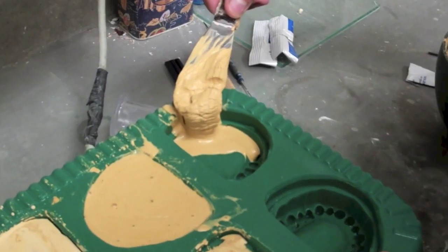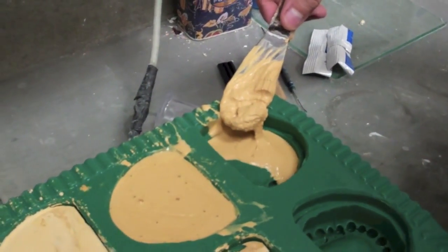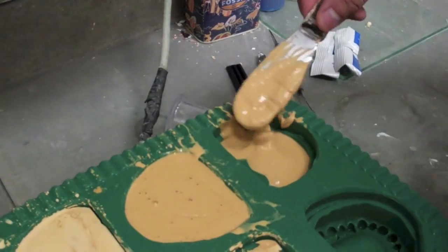Once the stone has set, you may pour the rest of the models. Repeat all the steps shown in the video until all six models are poured and set.